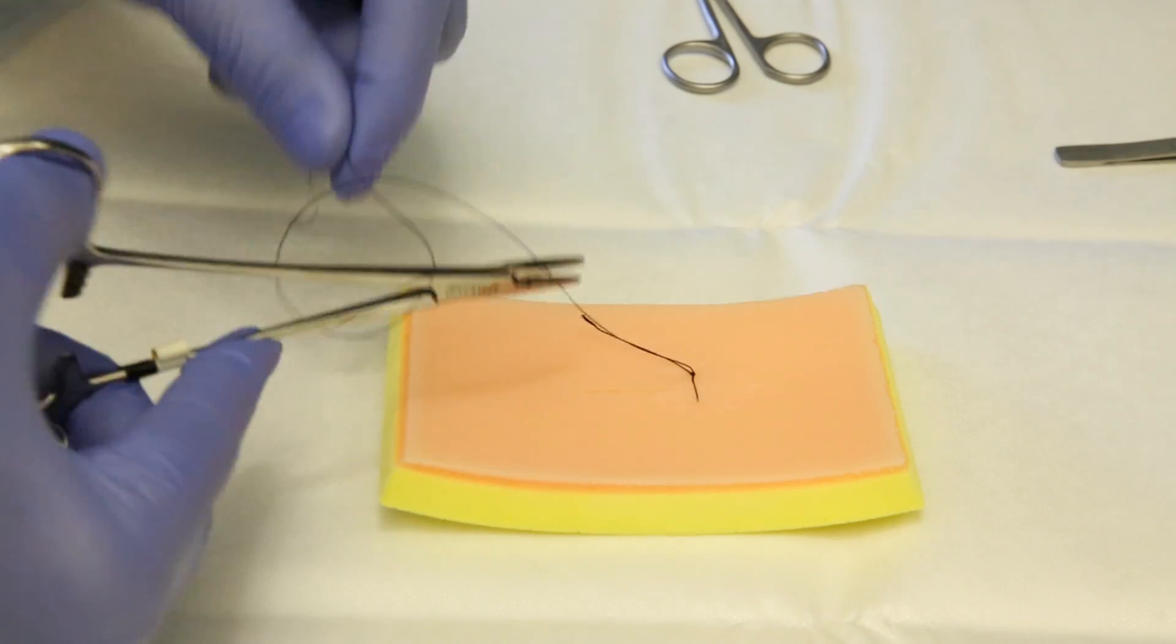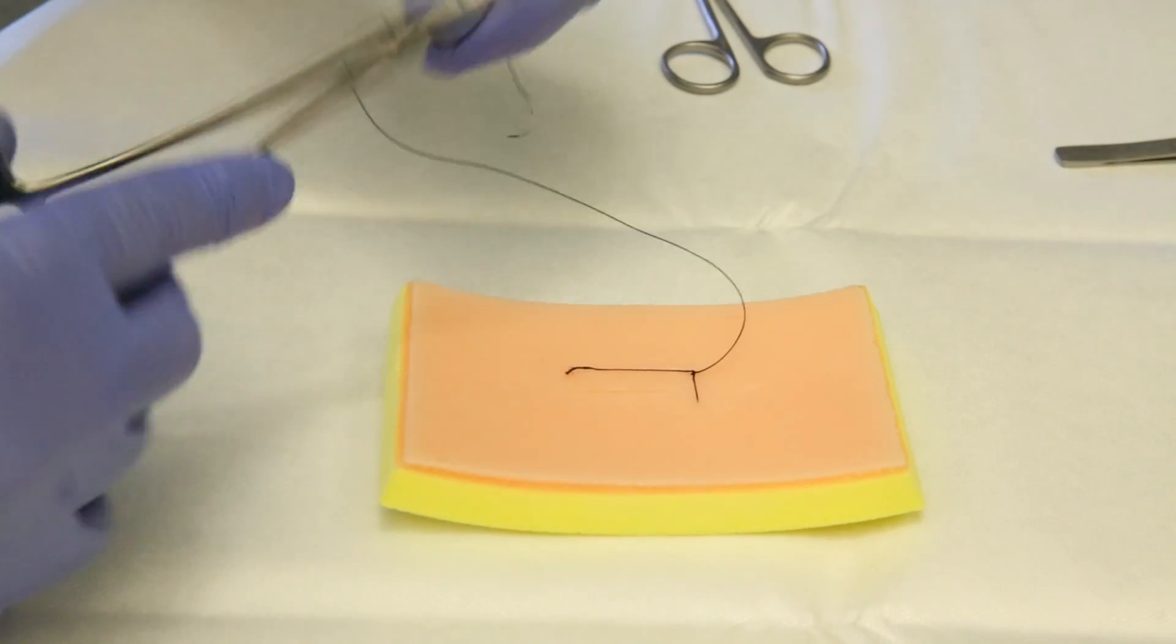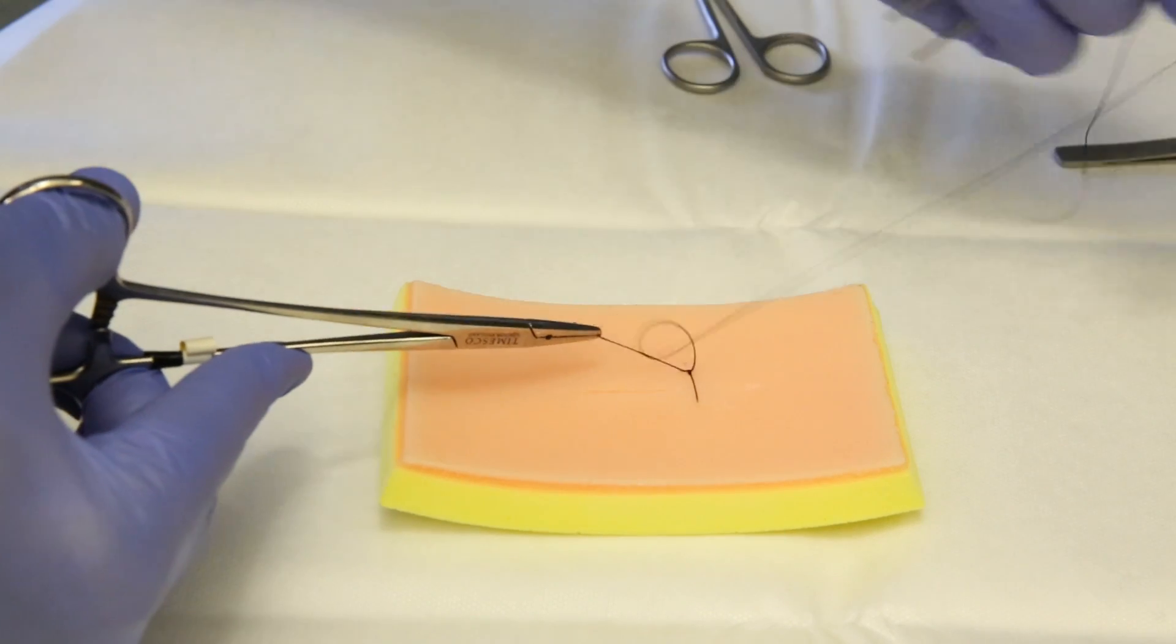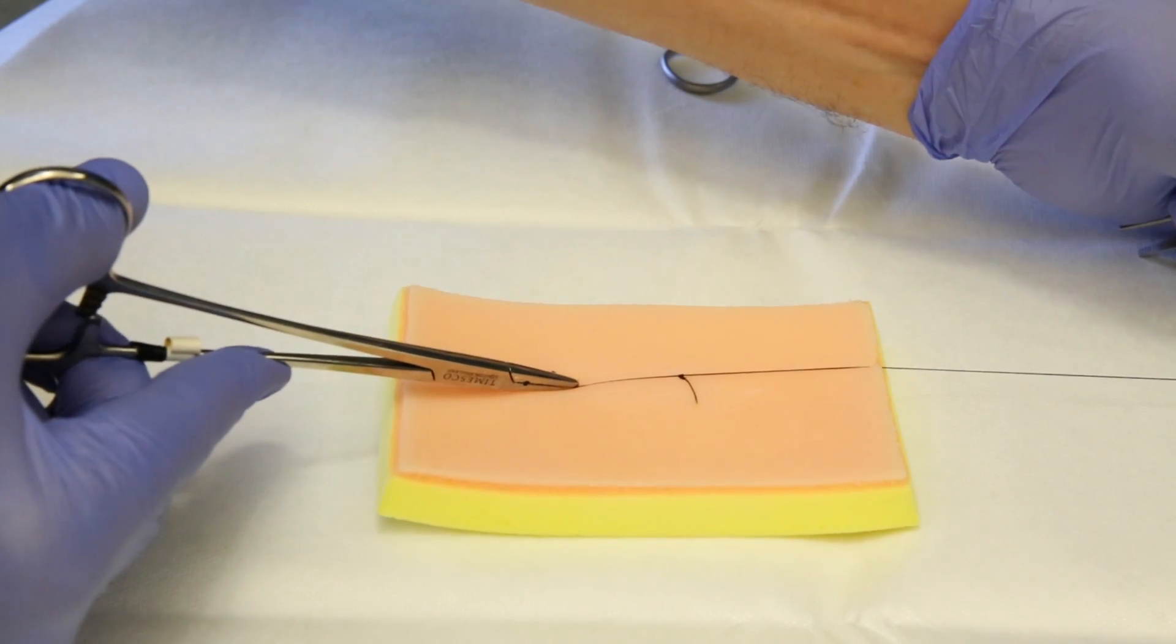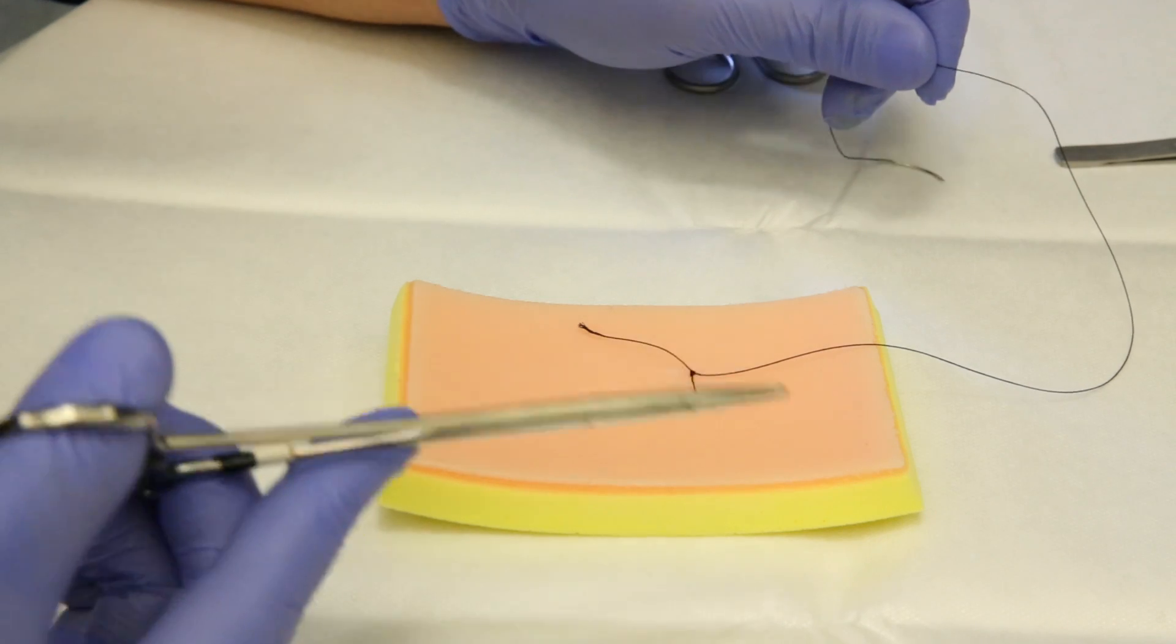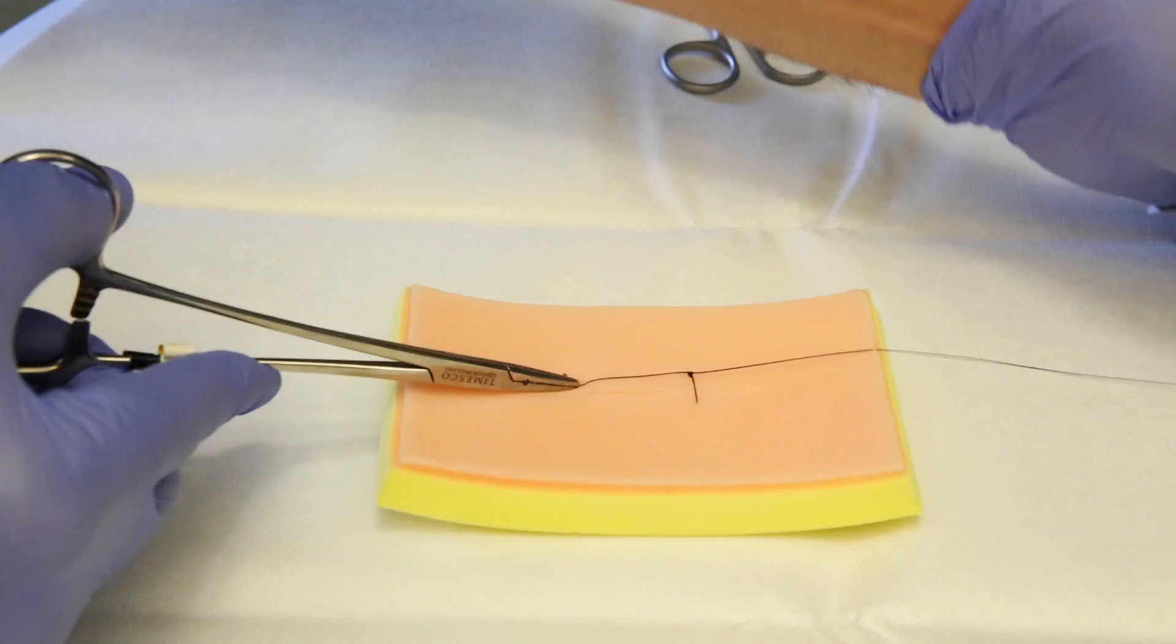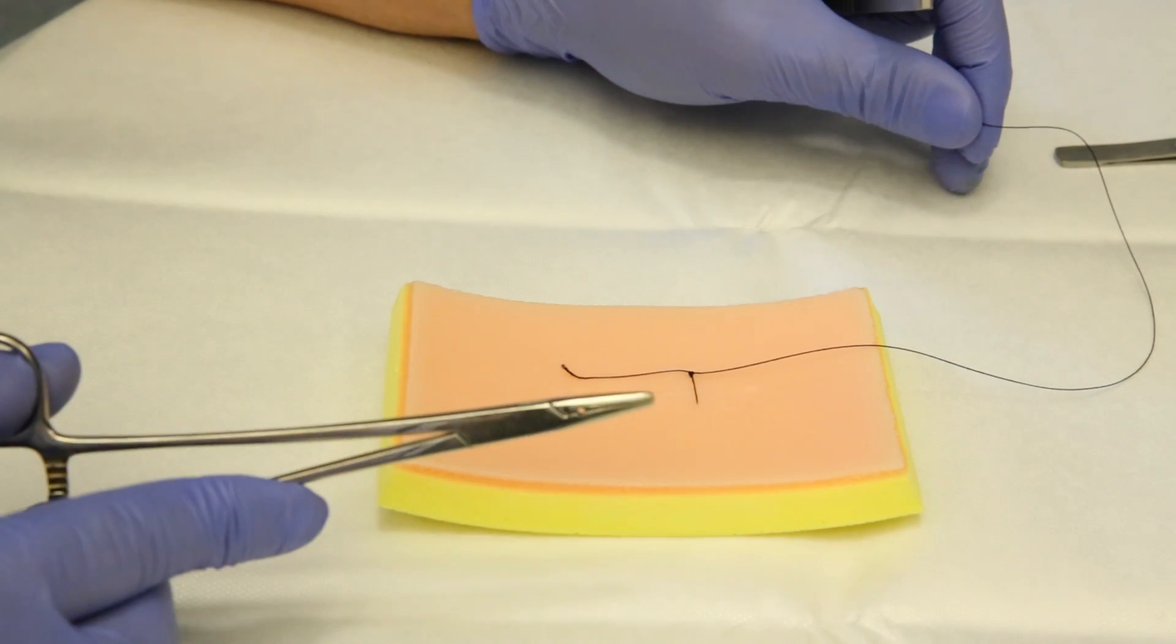You can make another one, another one. It depends on the size of the stitch you use. Sometimes we use four times, sometimes seven times. The smaller the stitch, the more the knots you need to do in order to secure it.